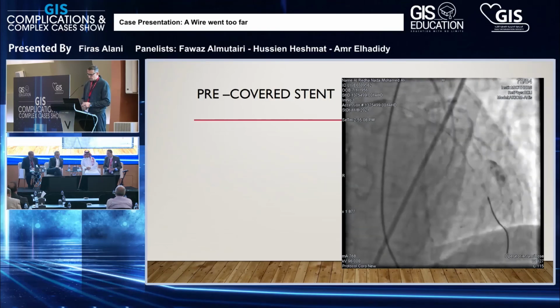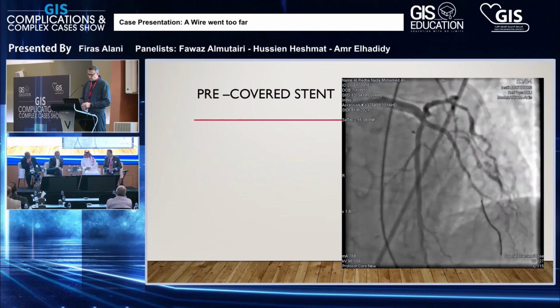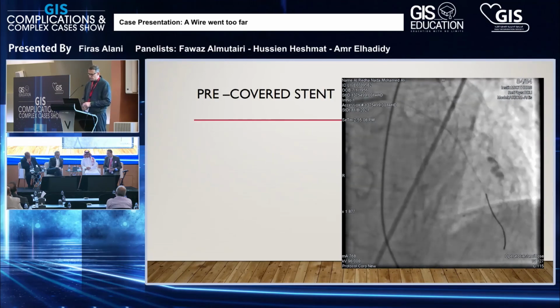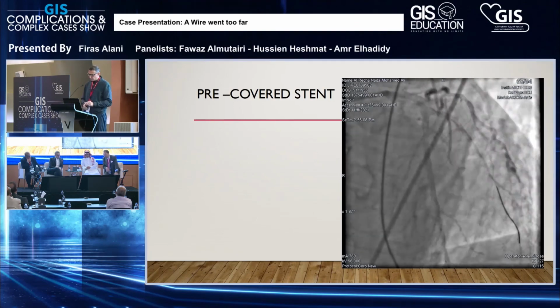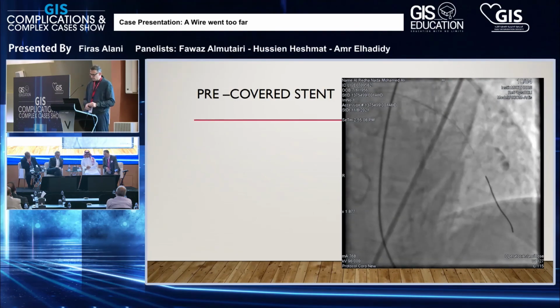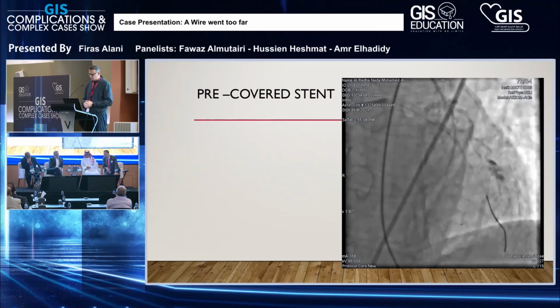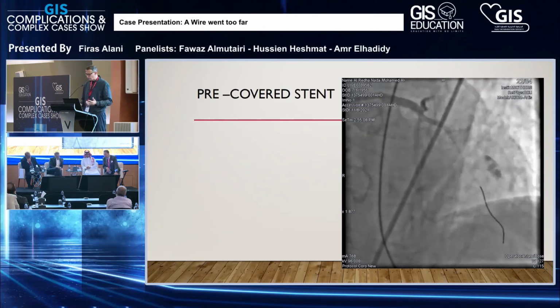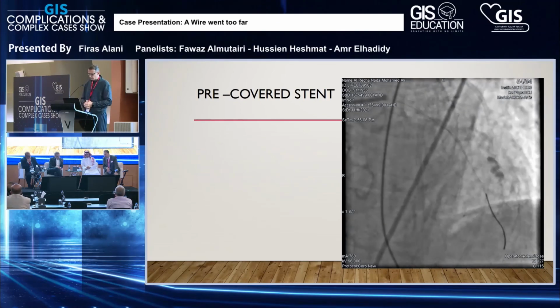And here you can see almost the tail of the injection towards the end of the injection. That kind of volcano eruption has a little bit of a wedge shape that tracks all the way back to that inferior branch. Question here is, this is now a 2.0 or even a 2.25. I don't think it's even a 2.25 vessel.